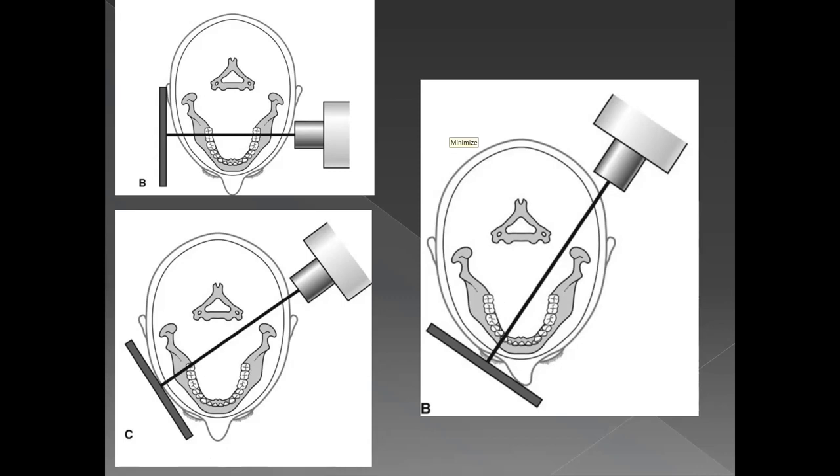Dr. Naman has a good question: what about the submandibular gland shadow? Well, since the submandibular gland is a relatively radiolucent structure, it does not interfere too much with your interpretation of X-rays in this area. However, I'm sure you know that on OPG, you do have a submandibular fossa, which if it is excessively pronounced, can mimic a huge cyst in this area. So that is why you have to clinically correlate your radiographic findings, all right? Sometimes you may mistake the submandibular fossa for osteoporosis or a huge cystic lesion in the posterior mandibular region, but actually that is just the submandibular fossa, okay?